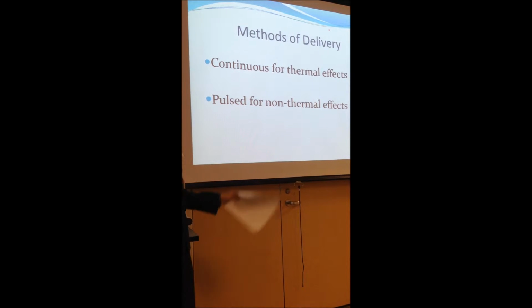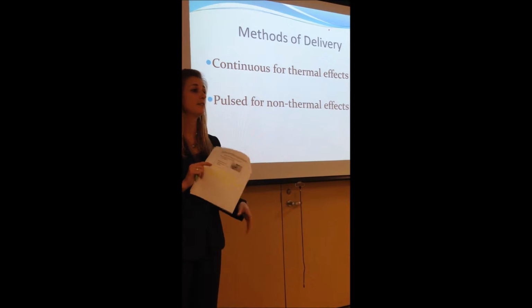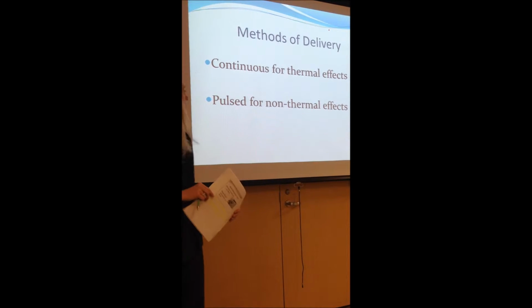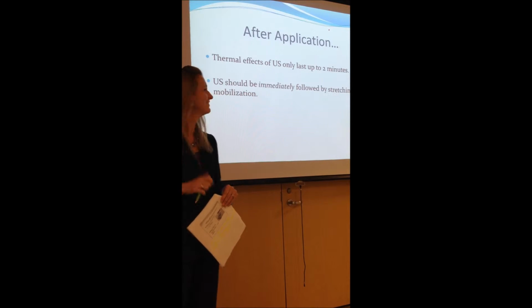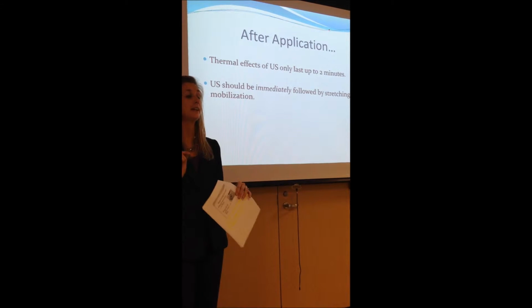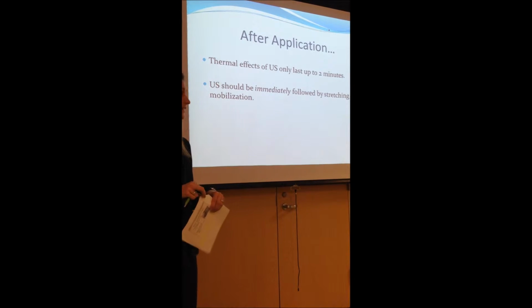Methods for delivery, we're mostly going to do the continuous. We want the thermal effects. We want the deep heat to the area to calm down the tissue so that we can eventually get some stretching or mobilization to achieve some functional goals. The pulsed mode doesn't have thermal effects, so we are not going to want that. After application, like I just said, these thermal effects only last for about 2 minutes. So you want to make the most of those 2 minutes. You want to stretch, mobilize, get some extensibility out of that tight tissue.